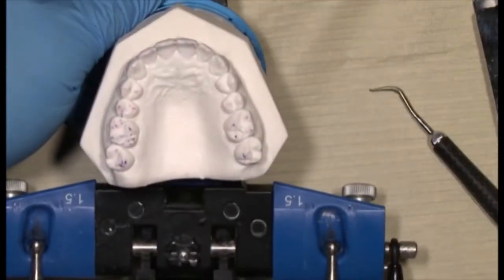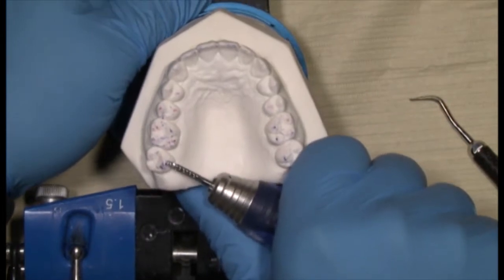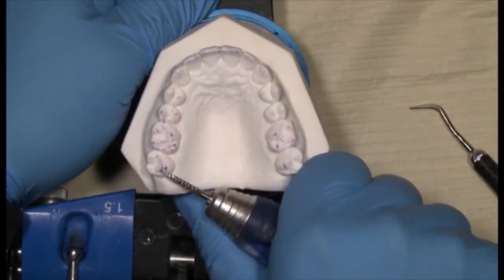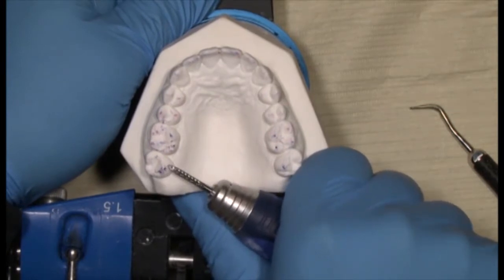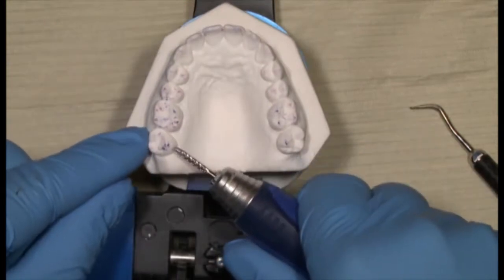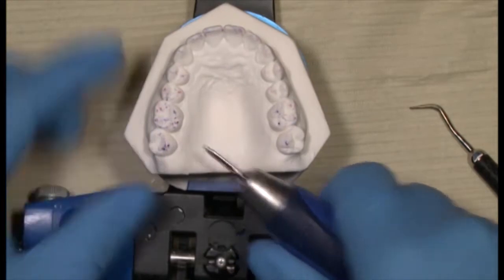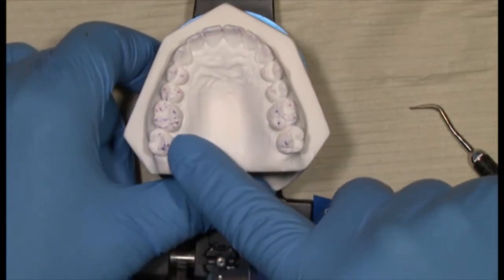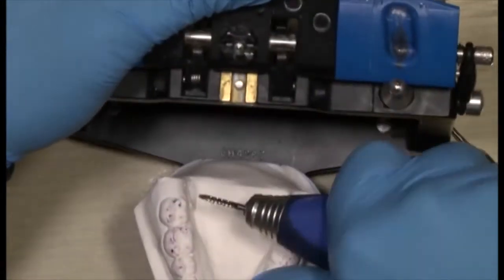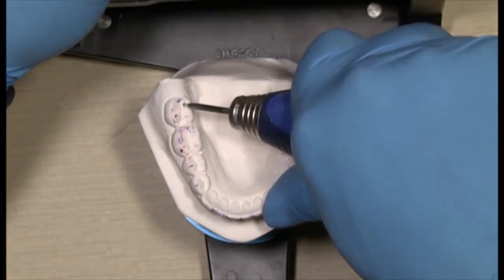So now you can see exactly what I mean. So be careful when these areas start to touch. That is not a cusp tip. This is on the outer aspect of these lingual cusp tips. This is why many times when you see these come back from the lab, if these are maxillary crowns and they're really fat and rolled, they present problems because you already know that that contact would be on the inner aspect of the lower tooth. So if you looked at it, that contact would be right there. That's not what you want.